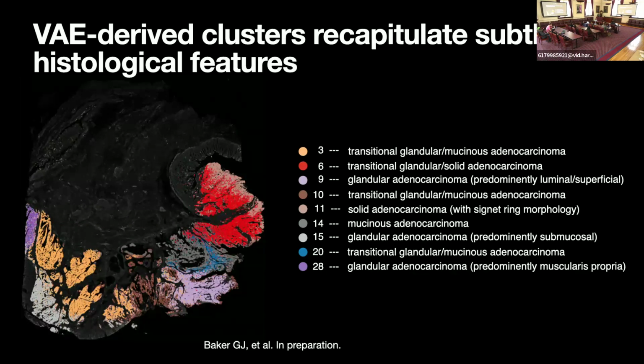And he said, oh yeah, absolutely. And went and labeled all the different cell niches, sort of tissue niches that were represented by these different clusters that you could identify, apparently the VAE could identify by just the texture of staining across all the different marker channels within the cell boundary itself, not even including neighbors.